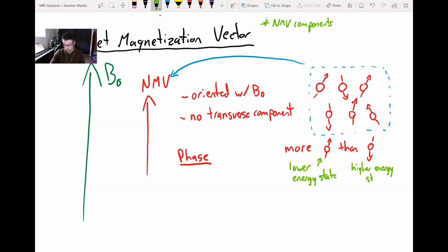And that is essentially why there's a surplus of atoms that are oriented upwards. There's more nuance to it than that, but not really worth getting into for our purposes, because at this point we can just jump into the net magnetization vector stuff and generally hand wave the complicated quantum mechanics that are influencing individual hydrogen atoms. We don't need to go there.